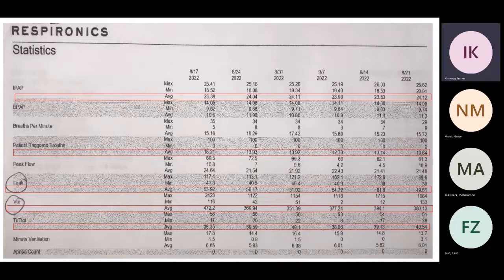What is next? I think next is this one. Apnea count or AHI, you see, it's all 0. That means the minute ventilation or the target volume is not being reached, not because of upper airway obstruction. The machine is fixing the sleep apnea part. Apnea time is 0. It doesn't have to be sleep apnea, by the way. Even when we get older, there's some degree of it. It's 0, so it's not an upper airway issue that's rendering your ventilation inefficient. It is your lung mechanics and your settings. Any questions?